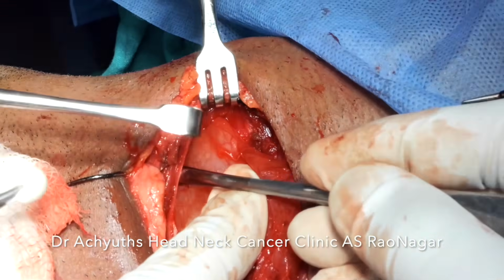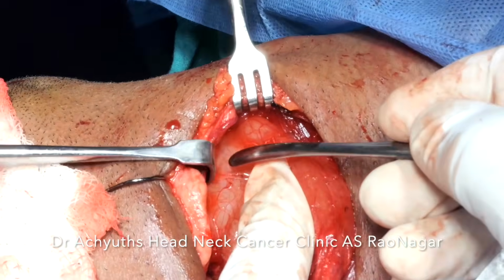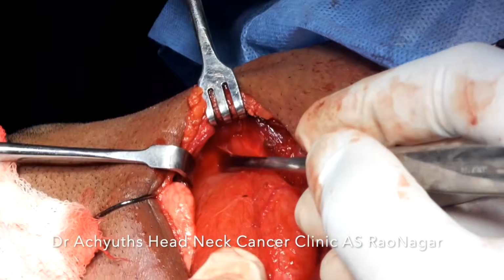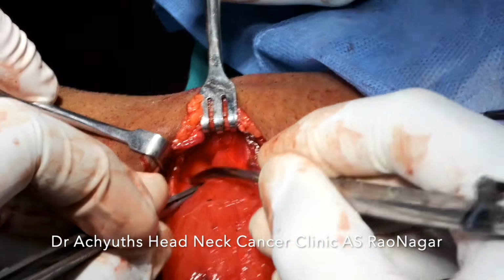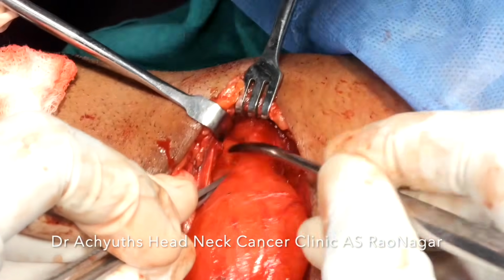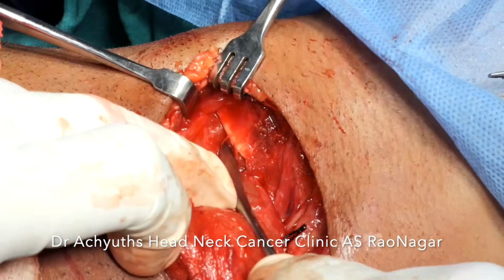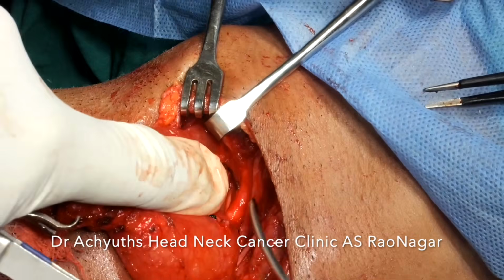Be gentle with the muscles. We will even ask the assistant to be gentle with the retraction. Don't use more pressure, because by this time they would lose patience and get frustrated with the surgery, so they'll be more harsh with the tissues.